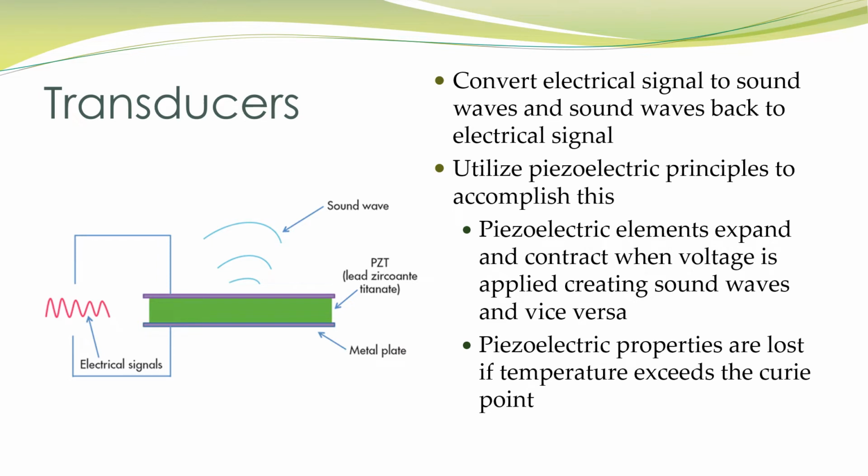So our transducers, as we've talked about in previous lectures, consist of basically the active components of our sound wave system. The face of a transducer will usually look something like a little matrix made up of all these things we call our piezoelectric elements. Across the matrix of this transducer, we would have many, many little tiny elements. And each of those elements would be what we call a piezoelectric element, or crystal as people sometimes refer to it. Now, a piezoelectric element is typically man-made.